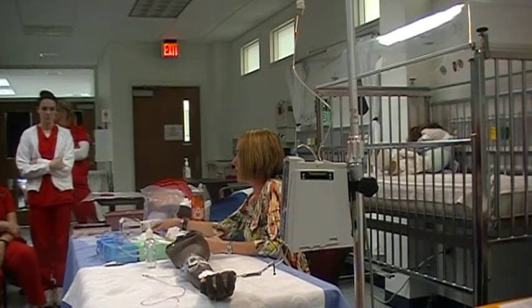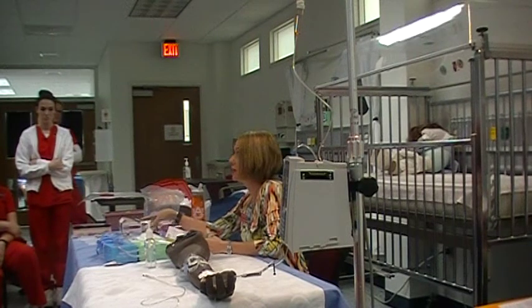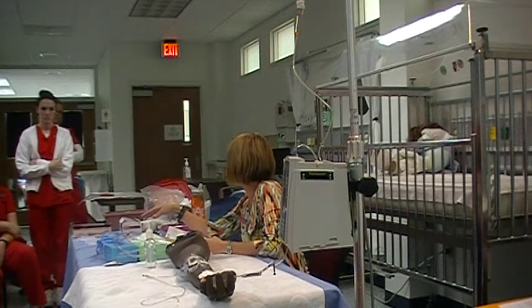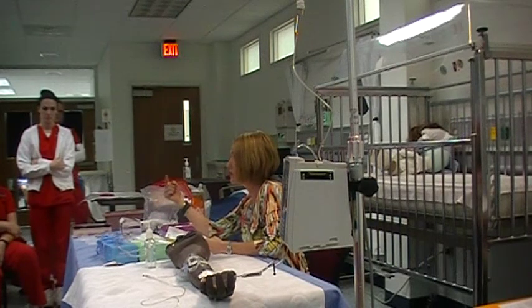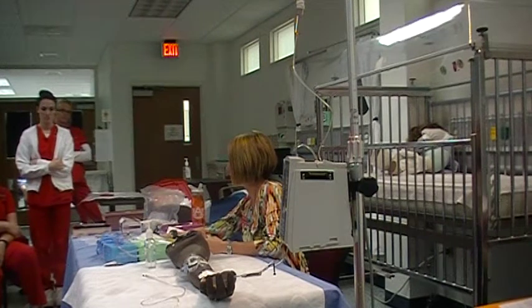You have everything, every size syringe. It's going to be your choice to decide which one you use. Again, I don't recommend that if you're giving 2 milligrams that you use a 10 ml syringe, unless you're giving something like Dilaudid, and you're going to need to dilute that, okay? So pay attention to how you're going to draw that up and what size syringe you would use.